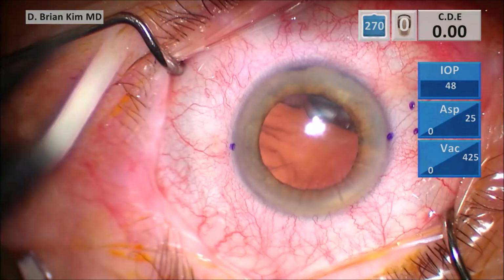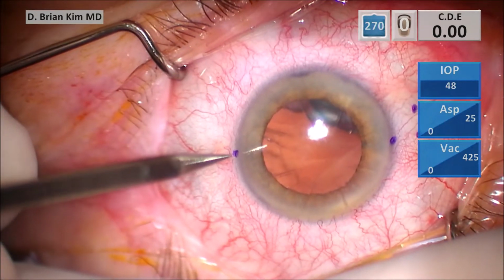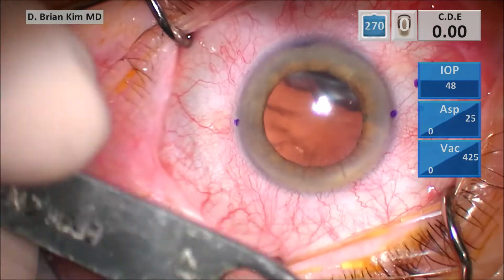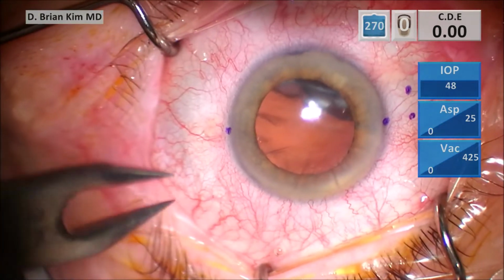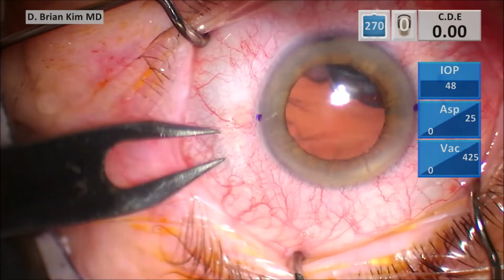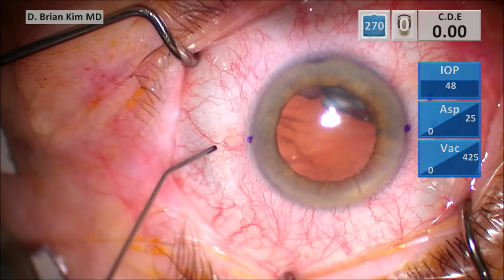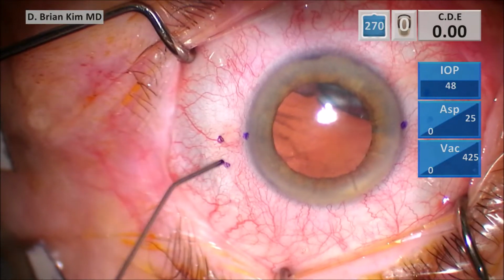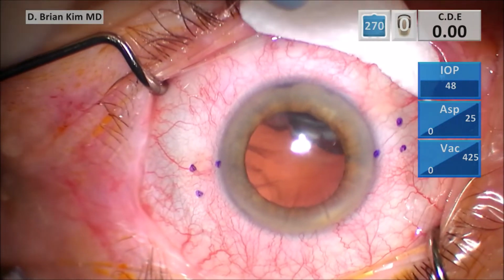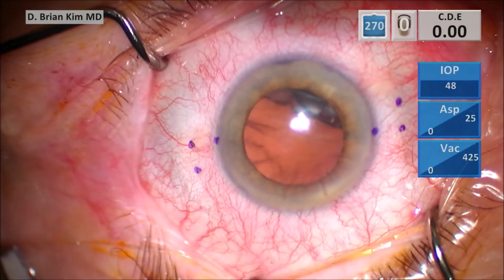Do the same thing on the other side using that fixed caliper. Again, 2.5 millimeters posterior to that mark in radial fashion, and then 2 millimeters adjacent, indenting the sclera, and then following it with the ink. Again, the pre-inked cannula to mark those spots. I like the cannula. It gives you much more discrete marks versus using the marker directly. It tends to bleed and smear everywhere. It's a less discrete mark.